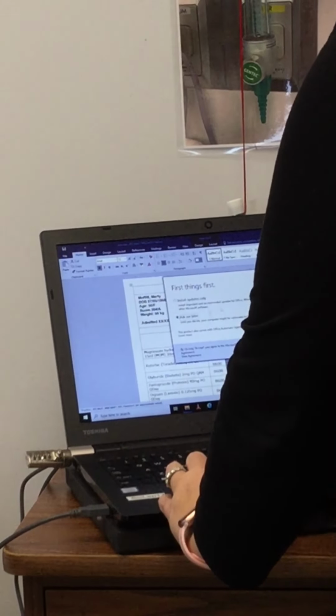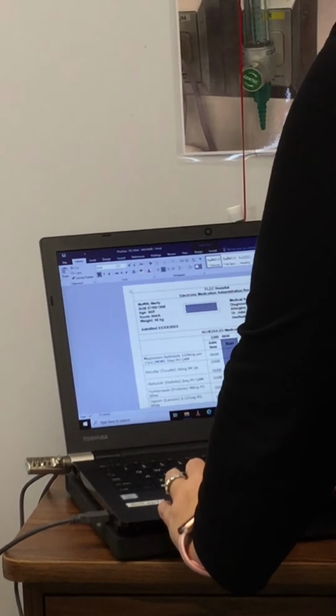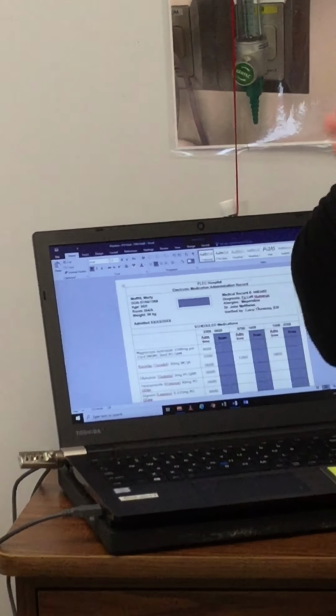And I'm not going to do an update right now. And the first thing I'm going to do is read through the top.